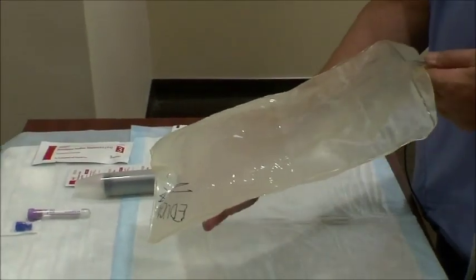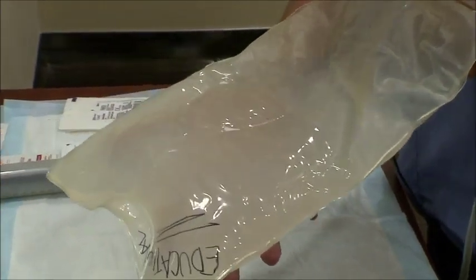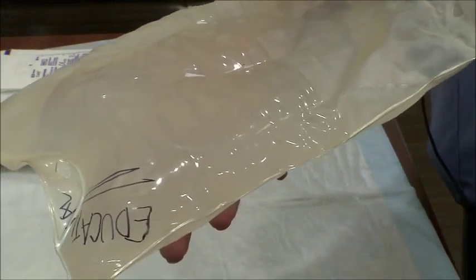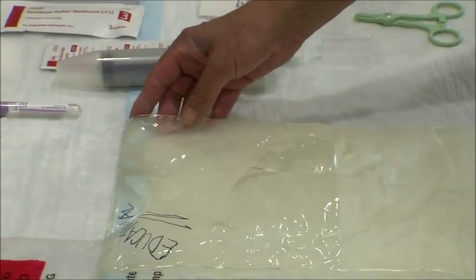When doing peritoneal dialysis, we have to check the waste fluid. It should be clear. You should be able to read through it. As you can see, this is turbid or cloudy. This is one of the first signs and symptoms of peritonitis. At this time, you should call the doctor and get an order for culture and sensitivity and also a cell count.